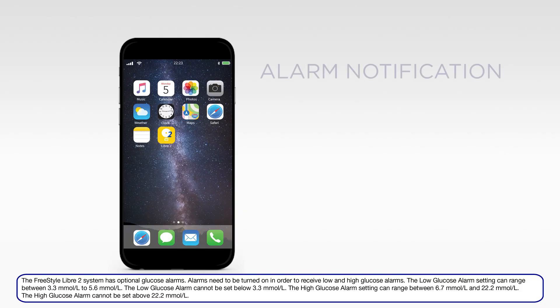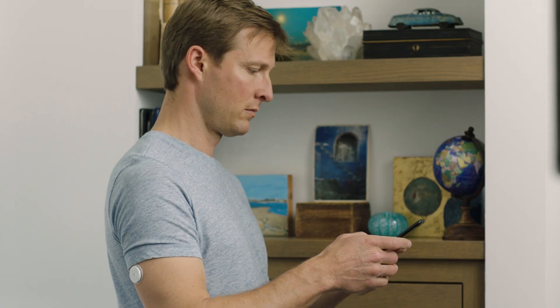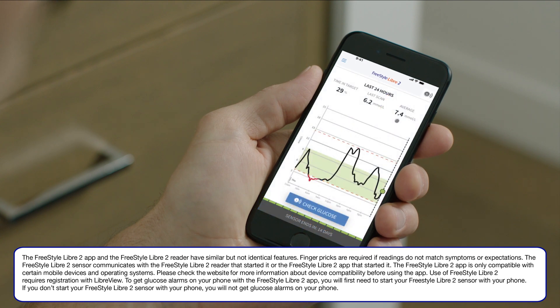The Freestyle Libre 2 app can automatically alarm you with a notification along with a sound or vibration when your glucose has gone above or below the level you set. To get glucose alarms on your phone with the Freestyle Libre 2 app, you will first need to start your Freestyle Libre 2 sensor with your phone.